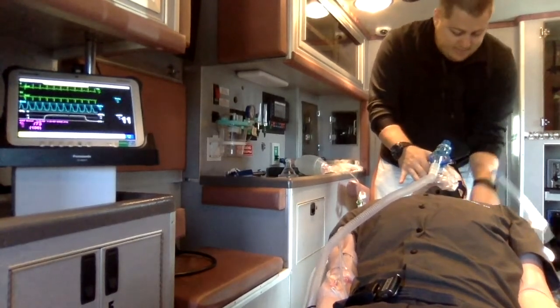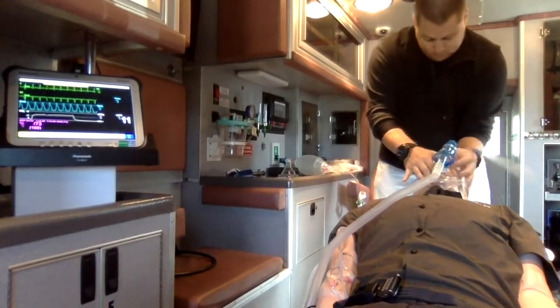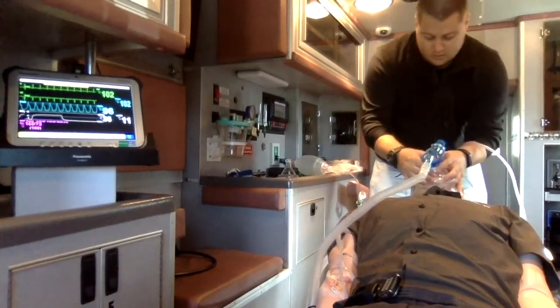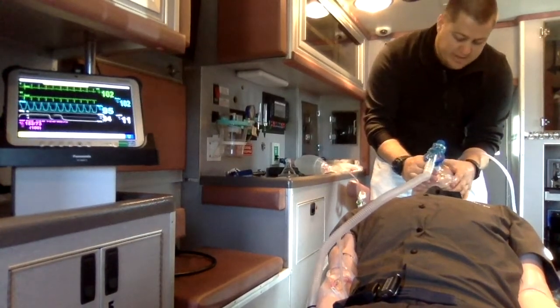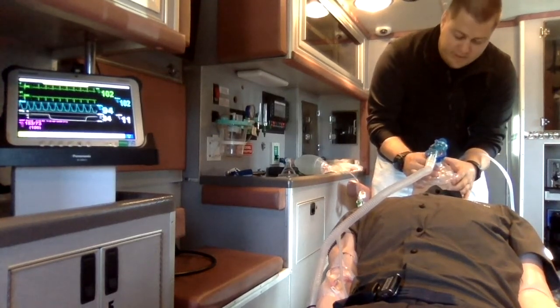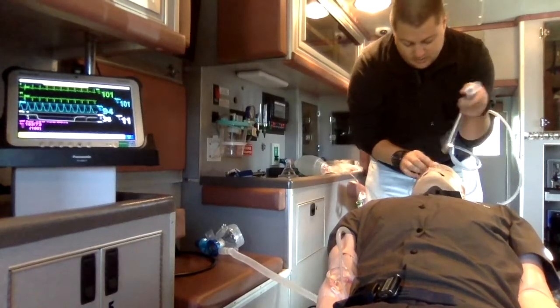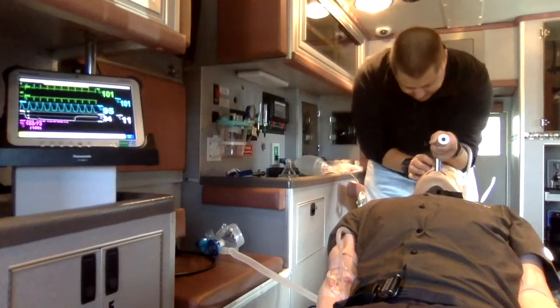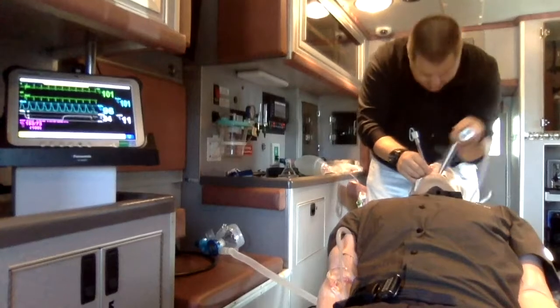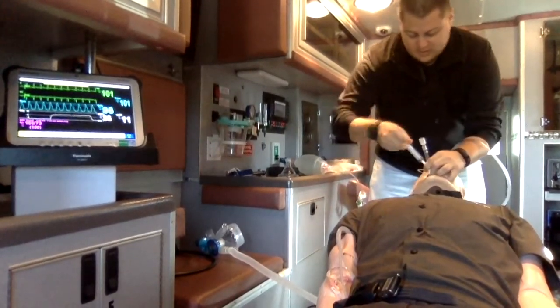I'm going to undo the mask settings here. I'm going to time it so it does give one last breath. Big breath in, big breath out. I'll watch end tidal. I got a good expiratory waveform. Discontinue that. Leave the end tidal in place. We're going to sweep his tongue. Airway's been identified. Airway's placed. Inflated.